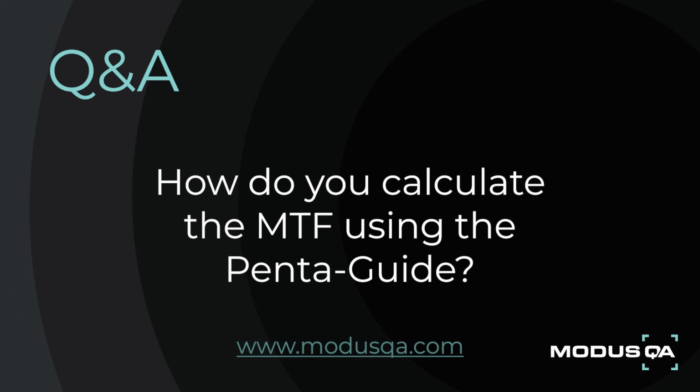So misalignment of the image detector has a significant effect on the MTF, so trending this metric can be used as an ongoing method to ensure that your detector alignment remains stable. So if you require more information on this, you can definitely contact us through our website, and we can provide a journal article reference that highlights how this has been validated.